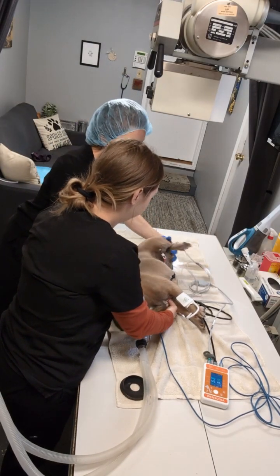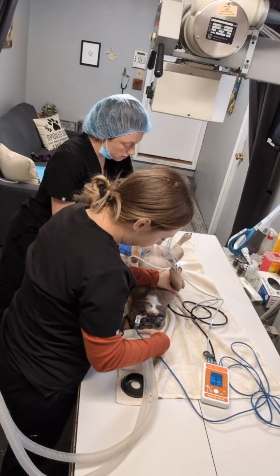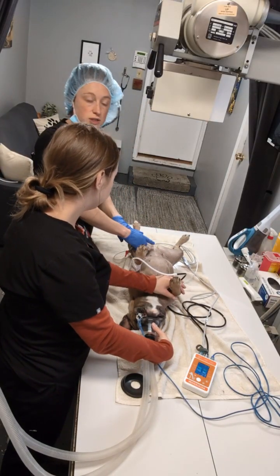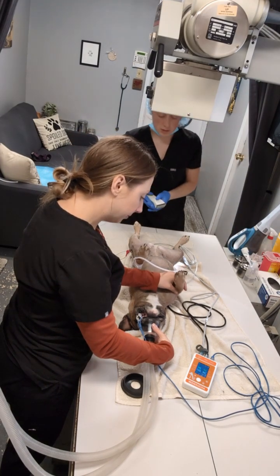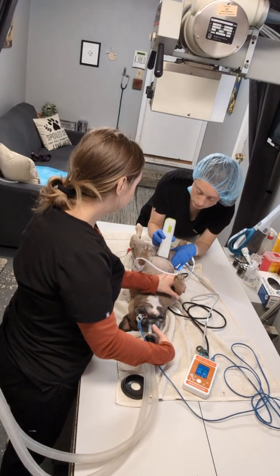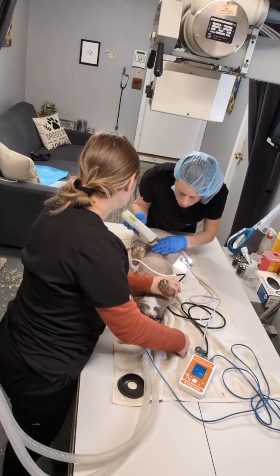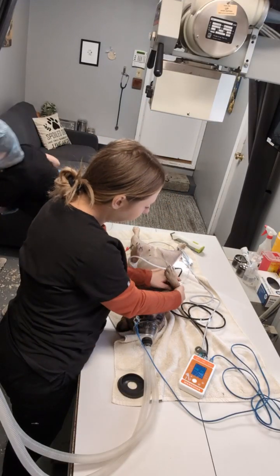So Magic's going to be getting a spay today. She's going to be in dorsal recumbency. So we will start by shaving. For a spay, we want to shave from the xiphoid to the pubis and laterally at the edge of the ribs. Okay, I want to vacuum up all of the excess hair that's around her.